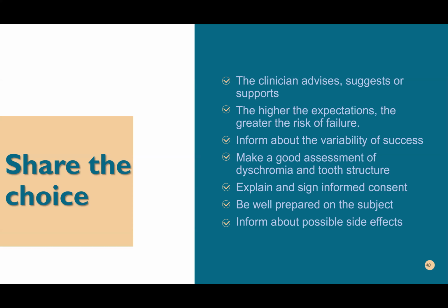Okay, so start with GBT to get a good prophylaxis and remove all the biofilm, and then you can use the click. If you have some red stains, use the airflow again with the powder and you can remove it pretty easily. But once again, it shows us that it's not the optimal treatment, because if there's red, there was biofilm. So the optimal contact between the product and the enamel wasn't present.